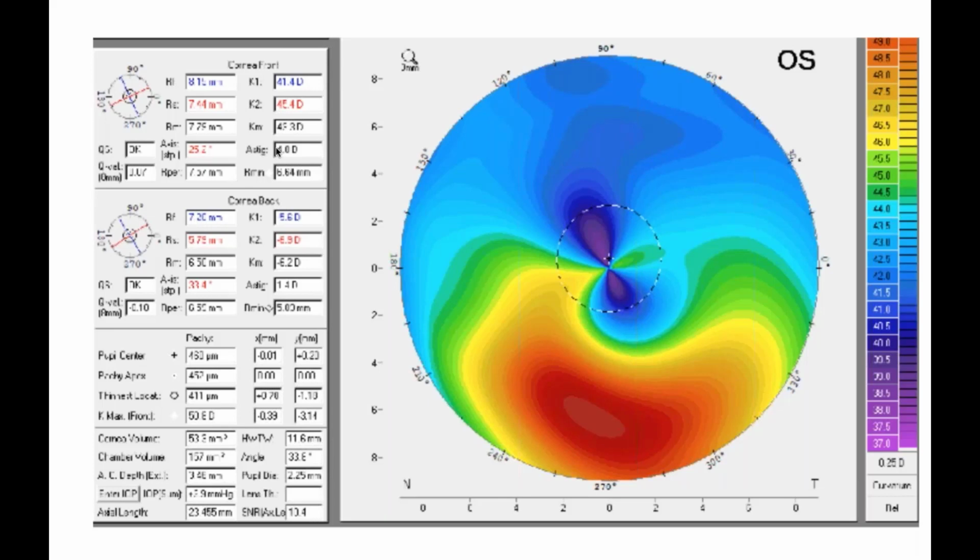But I have seen corneas somewhat normalize after cross-linking, so I tend to cross-link people before we consider cataract surgery and let them normalize for 6 to 8 months, maybe a year, and then come back and reconsider. But regular, repeatable, and orthogonal are the rules you have to follow for a toric lens, and 2 or 3 of those rules are almost always broken with keratoconus. When you start breaking rules, you're rolling the dice on outcomes.